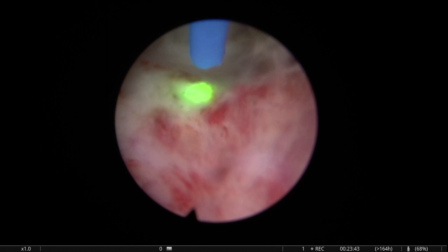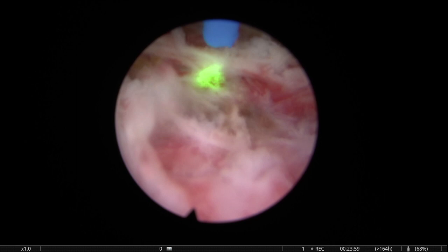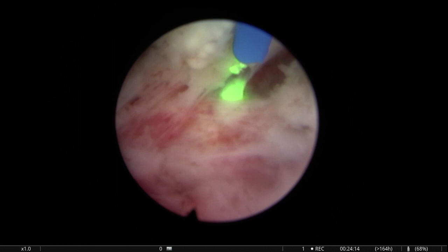After all, we are trying to remove the meat from the orange, from the capsule, to peel off, like Tevaho was saying the other day. I like to peel off. It's not dissection through cutting, it's dissection through localization of the right plane and development of this plane. All right, so here, again, this is the posterior aspect.